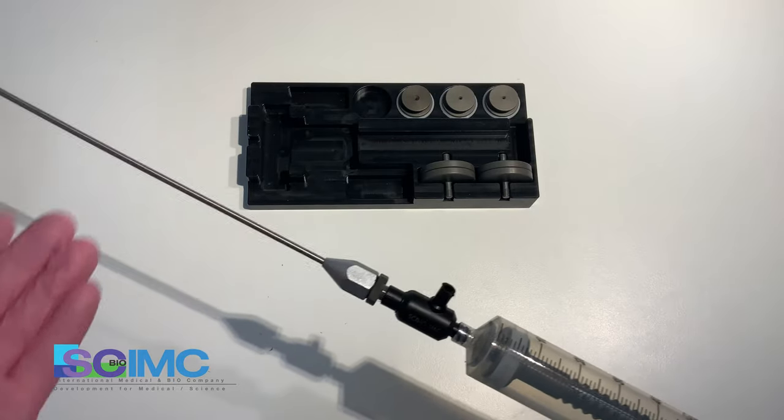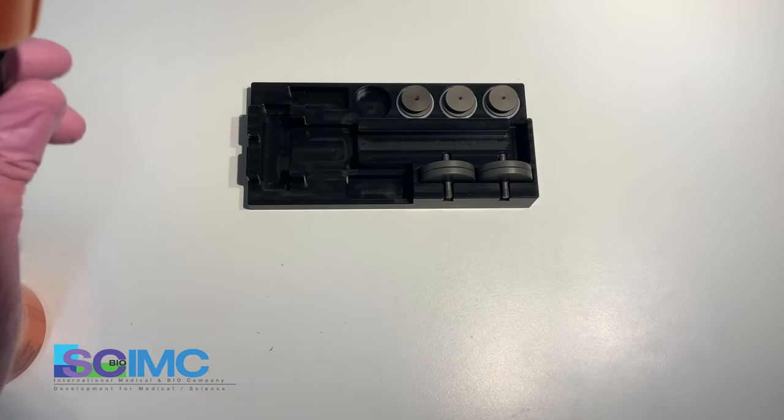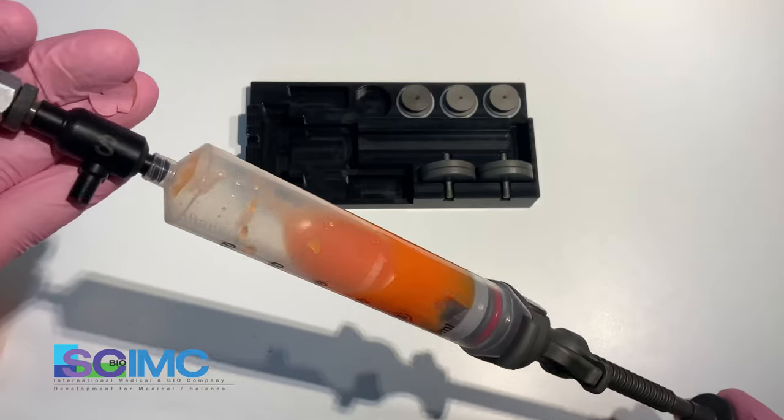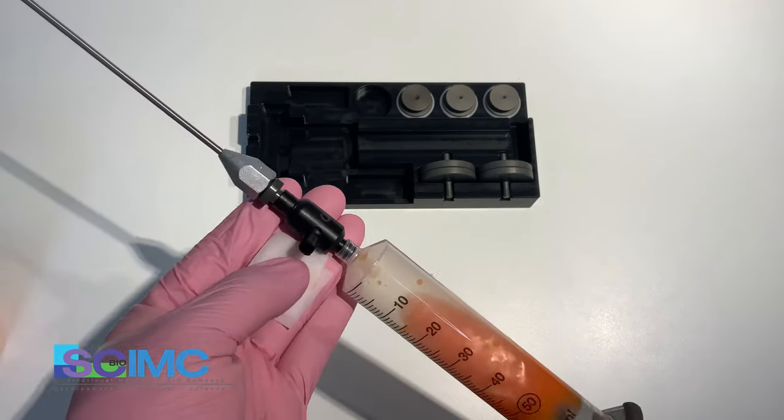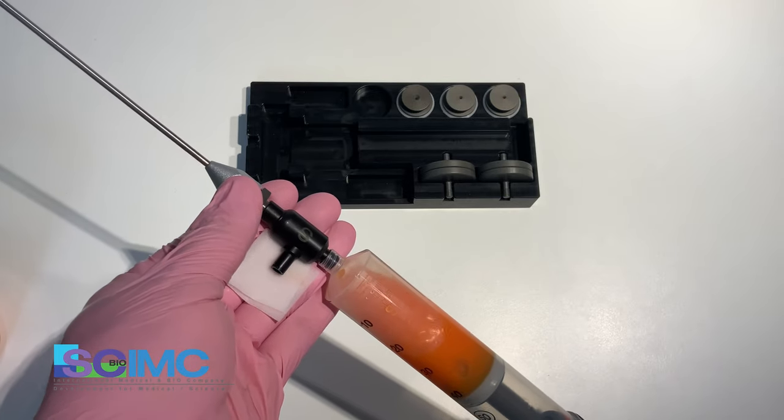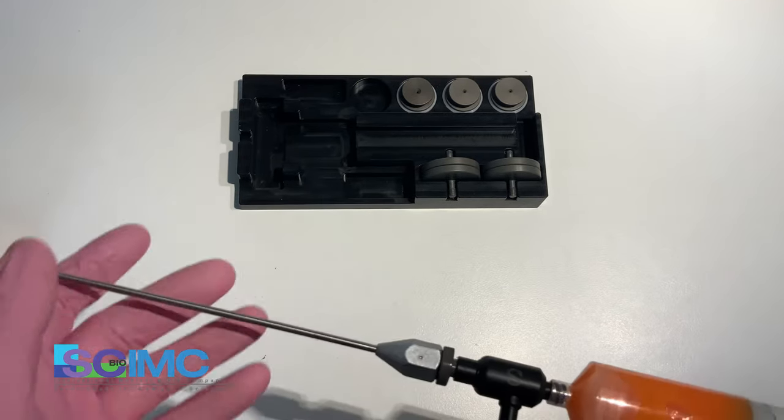Is it ready to suction? Need to remove air. No need to hold the cannula. The air comes out here. And start suction again.